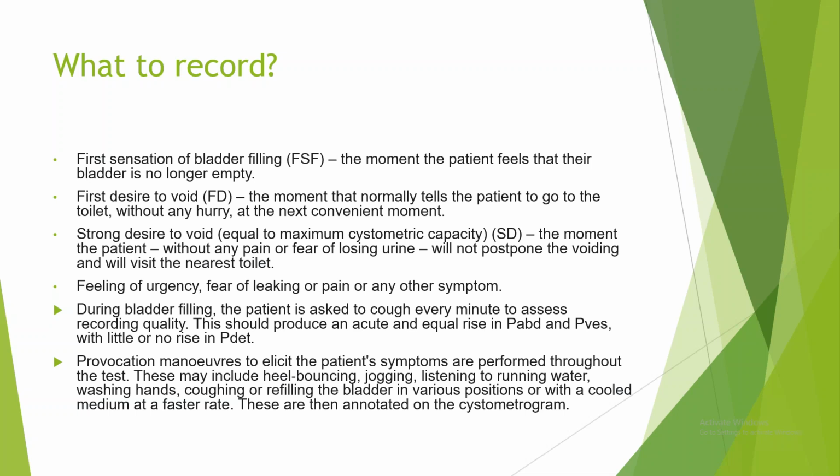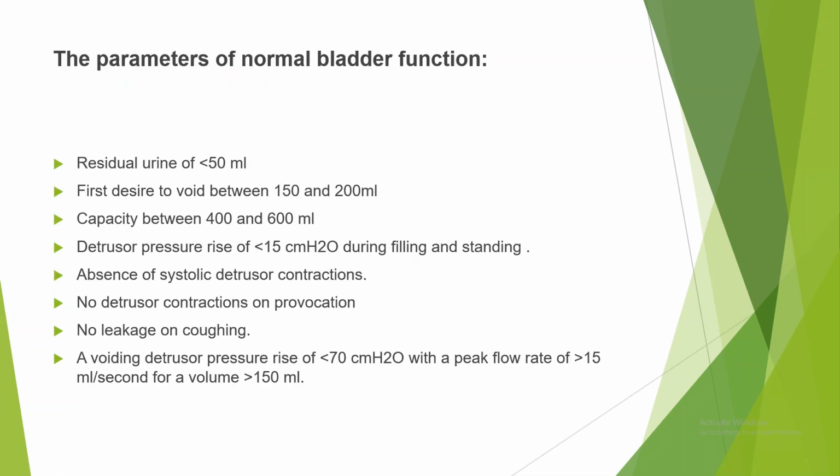So there are settings in the machine for all these actions. We just have to click the button there, to show that the patient has done these provocative measures. And we have to see if there are any changes in the pressure.